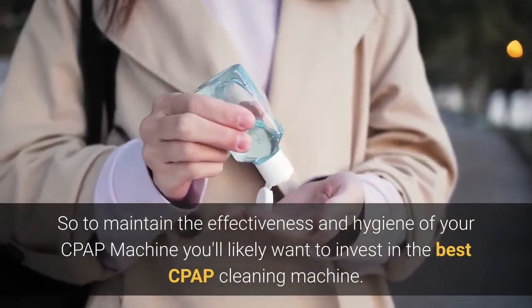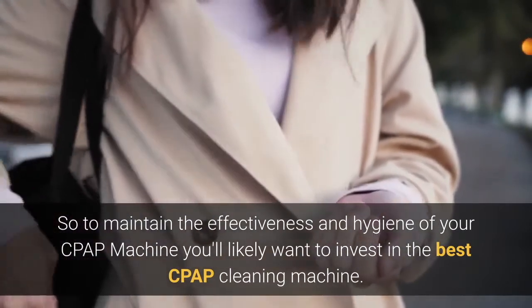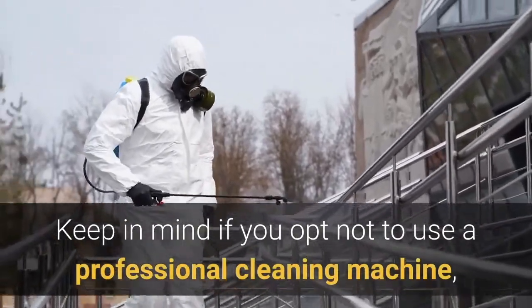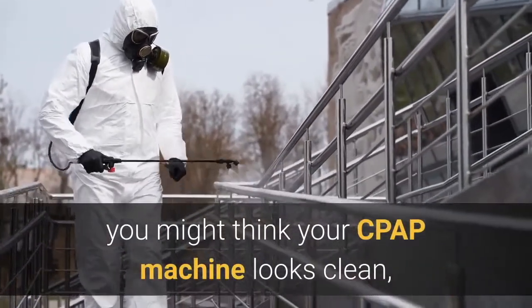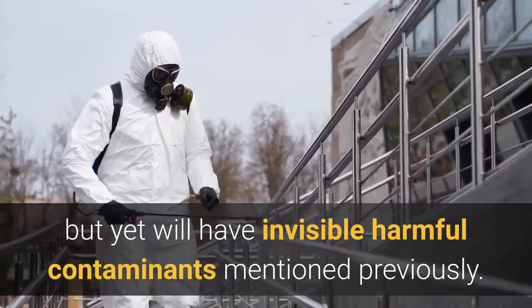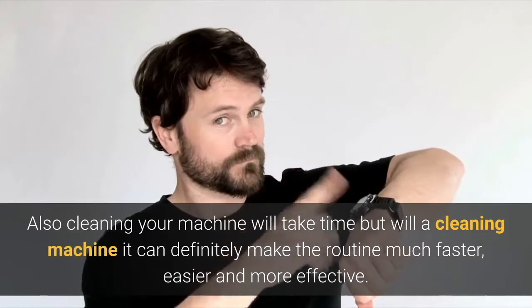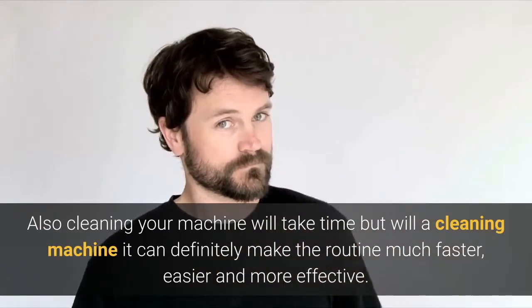To maintain the effectiveness and hygiene of your CPAP machine, you'll likely want to invest in the best CPAP cleaning machine. Keep in mind that if you opt not to use a professional cleaning machine, your CPAP might look clean but still have invisible harmful contaminants. Also, cleaning your machine will take time, but with a cleaning machine it will be much faster, easier, and more effective.